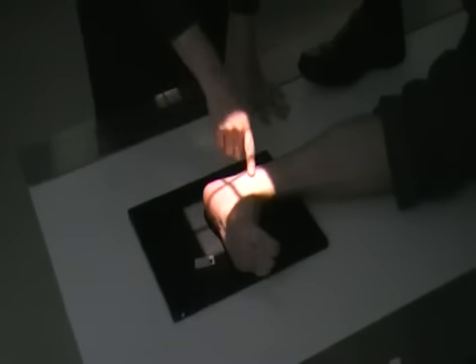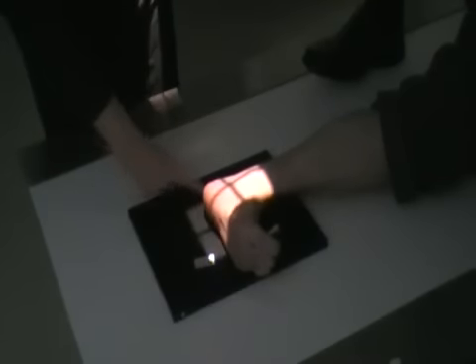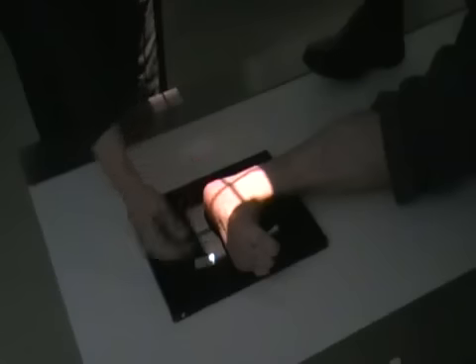And then from the medial malleolus, you're going to have your central ray come down approximately one inch. We do not need to include the entire foot, so your central ray will include the very back side of the calcaneus and then halfway into the foot.